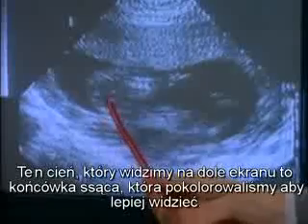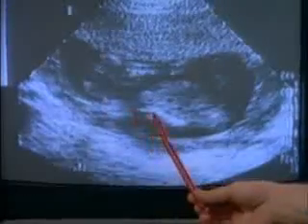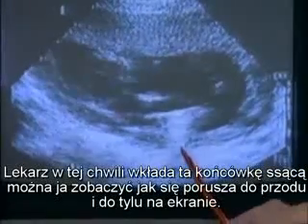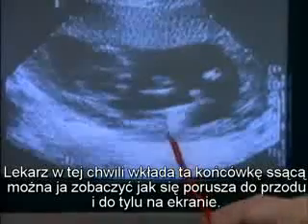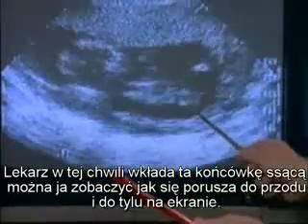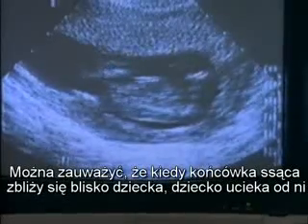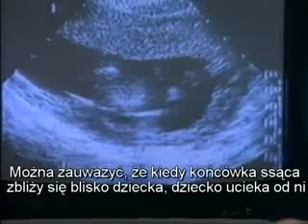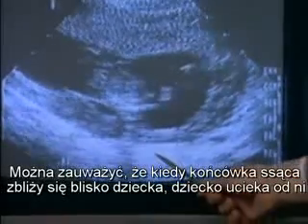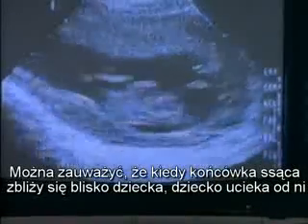We have colored the suction tip deliberately in order for you to discern it more clearly. But the abortionist has now dilated the cervix and is now inserting this suction tip, which you can see moving back and forth across the screen. You will note that as the suction tip, which is now over here, moves toward the child, the child will rear away from it and undergo much more violent, much more agitated movements.